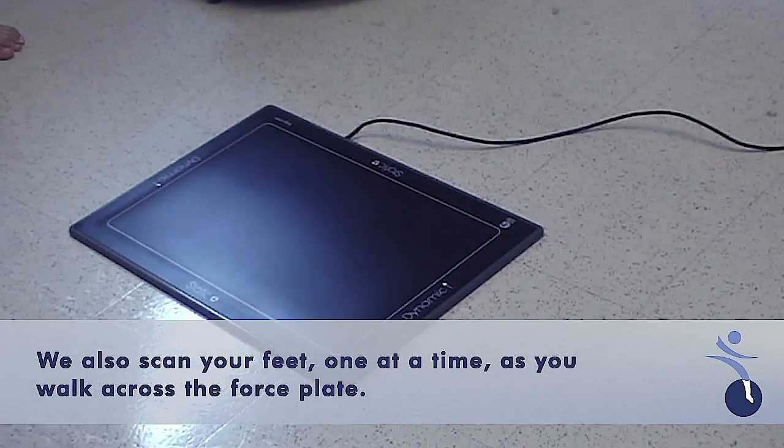For the second part of the orthotic scan, we're going to do one foot at a time. I'm going to have you start with the right foot. You're going to walk through the board, just placing your right foot in the middle.